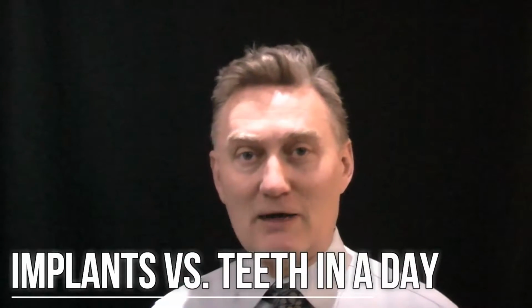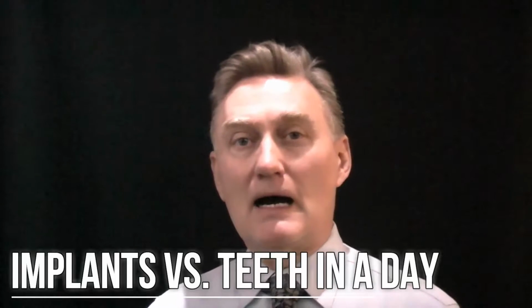Now this concept is not new. Although traditionally we did implants in a staged process, as I described earlier, implants in a day has been around for at least 15 or 20 years, and that's one of the services that we offer as well. There are some key differences that you have to be aware of. Implants still take the same length of time to heal, whether you do them in a day, teeth in a day, whether you do them in a staged process.